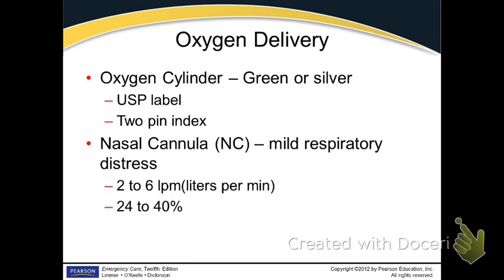When we talk about a drug, we always have a dose, right? You have a dose of Tylenol. You have a dose of oxygen. The dose is in liter flow, liters per minute, or LPM. So when you see this, LPM, that's liters per minute. That's the dose. So liters per minute is the dose of oxygen. And this, you just dial this in here.